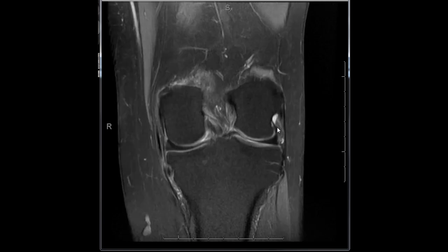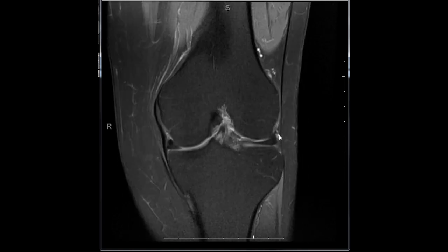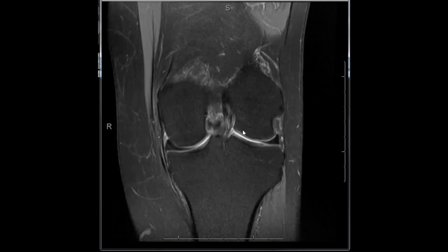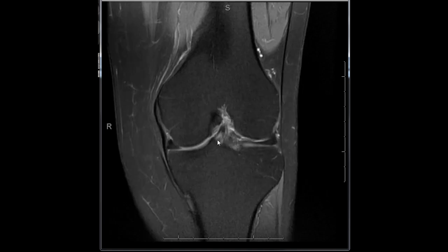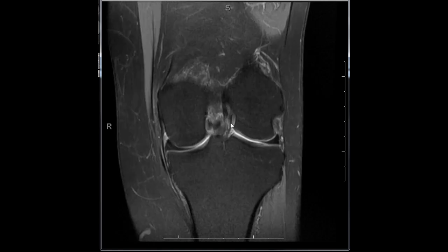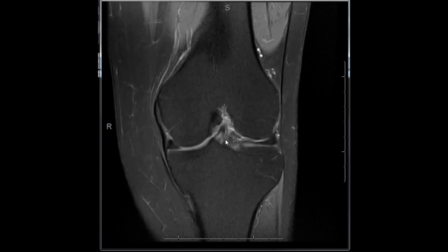The anterior and posterior cruciate ligaments should be evaluated on multiple planes. You can see the ACL on the coronal, sagittal, and axial planes. The ACL begins in the lateral femoral condyle and extends anteriorly and inferiorly — caudally — to the level of the tibia, which is seen in its entirety here. There are two bands: the anteromedial and posterolateral bands, which are sometimes clearly distinct.